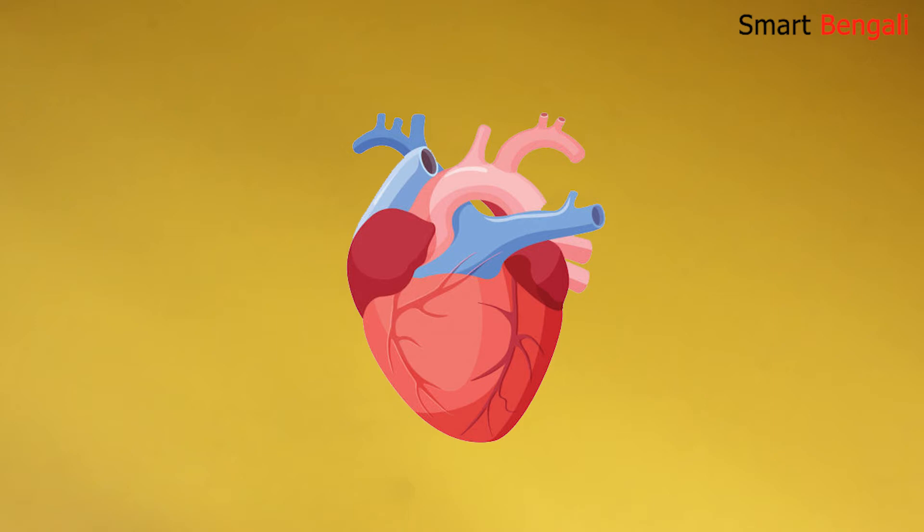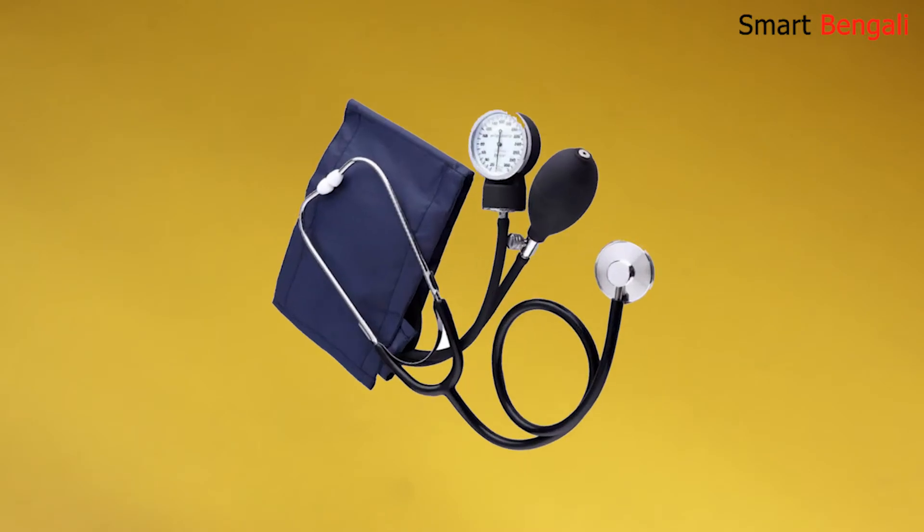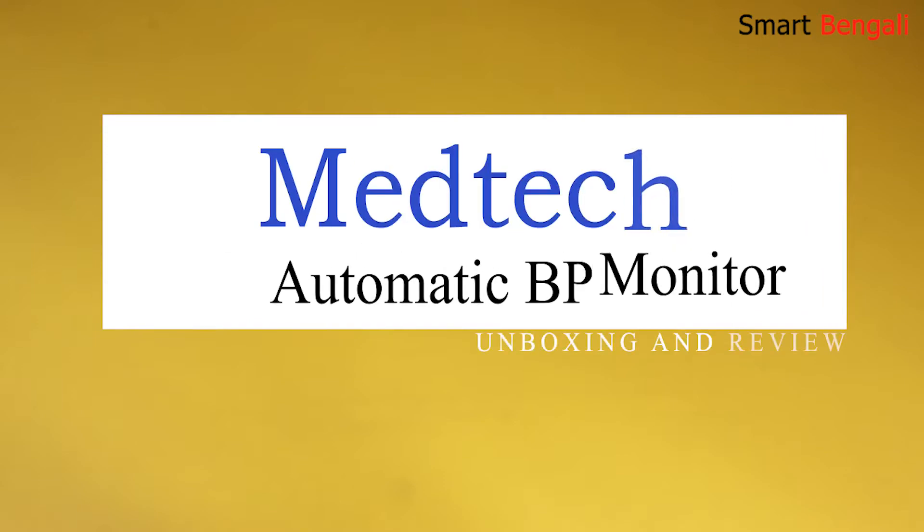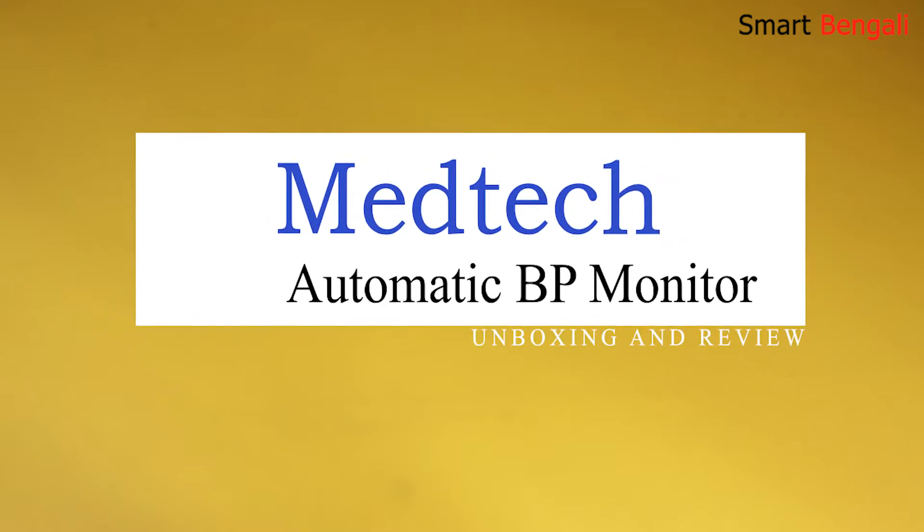My father is a heart patient and I monitor his BP regularly with a manual sphygmomanometer. But I was looking for a small portable digital device, so I purchased a digital BP monitor machine from Medtech. In this video I am going to unbox and test this BP monitor machine from Medtech, and I will also compare the result with a manual BP machine.